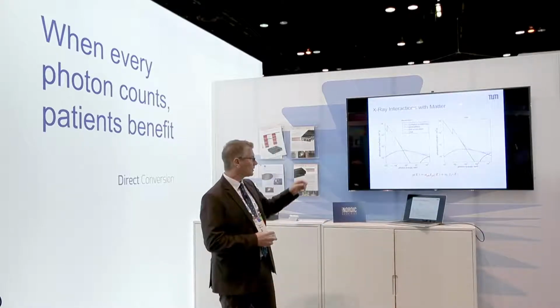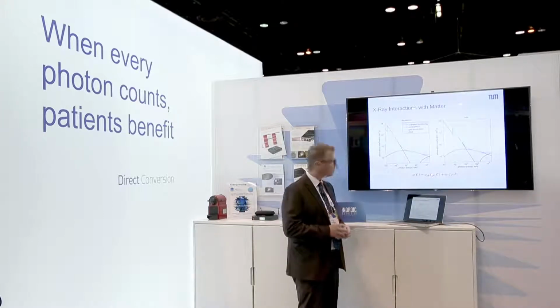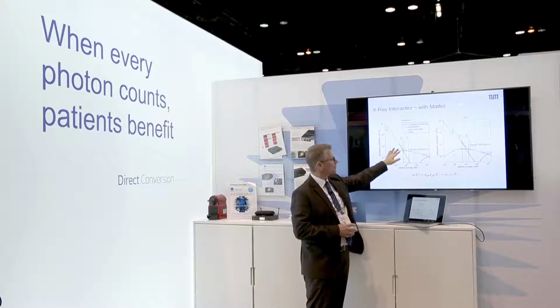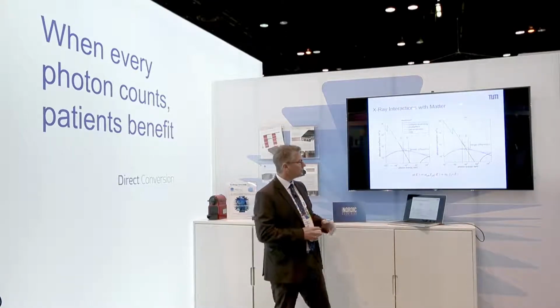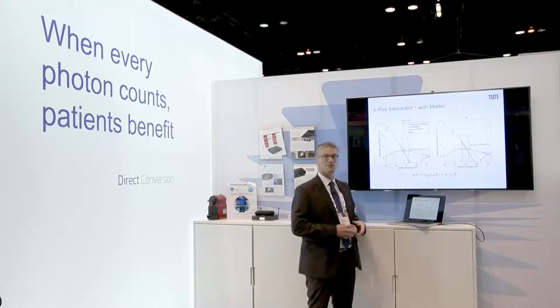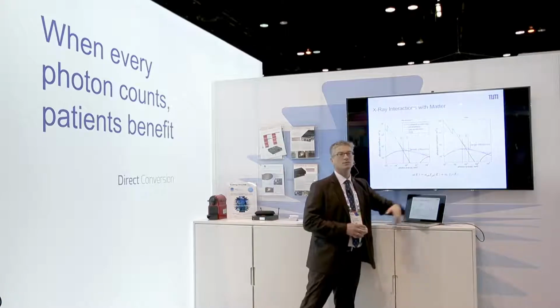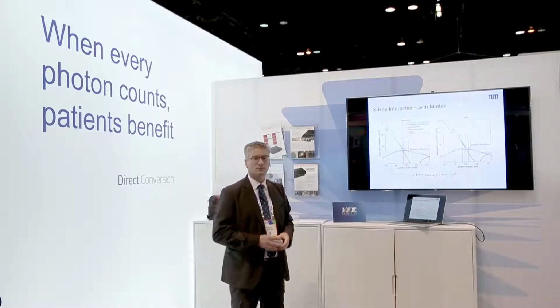Now, if you look at these two energies and the two plots, you can actually tell the difference, because if you take one energy here, one energy here, there's a small difference, for example, in aluminum and a large difference for iron. That means that by measuring two energies, we can actually extract the ratio of the photo and the Compton coefficients and tell the difference of different materials.